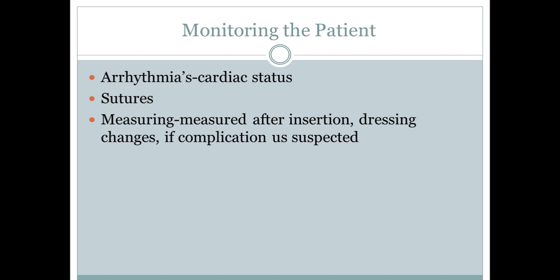Another odd side effect of central lines, since it is directly in that central venous circulation, is that patients will complain, or if you've ever had a central line, that immediately when you start flushing, the patient will complain of a metallic taste or a salty taste in their mouth. It's something that will dissipate after a few minutes, but it is unpleasant, especially if you have somebody that's continually having those lines flushed with normal saline.